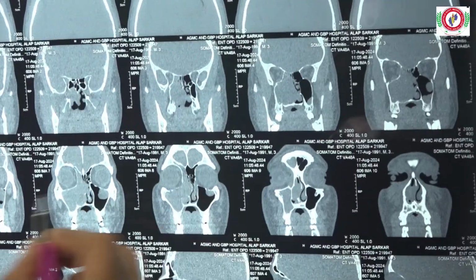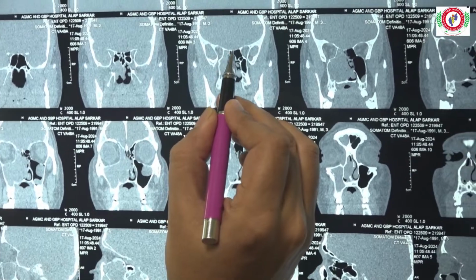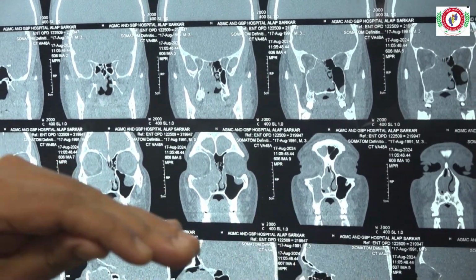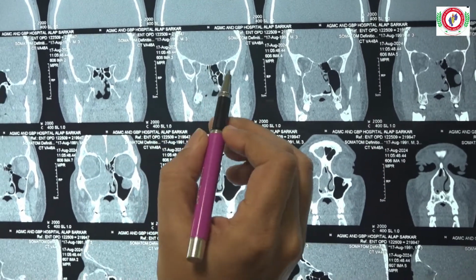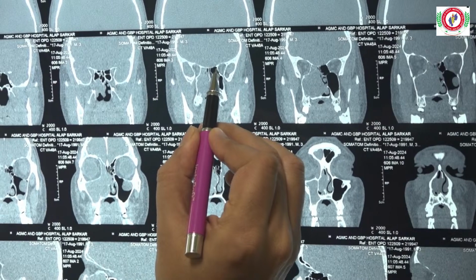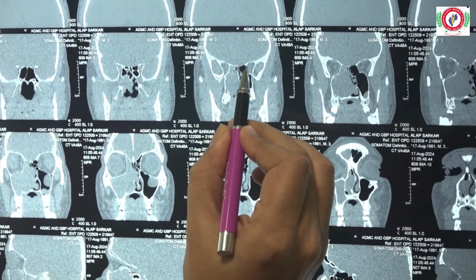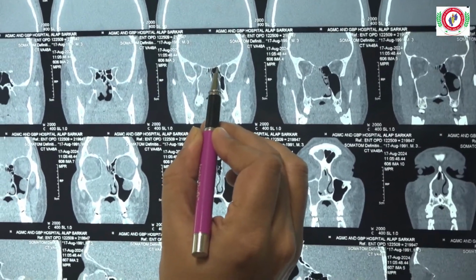Now till this point there is no sphenoid sinus. Alright, it is all posterior ethmoids. And also note the skull base. See the skull base anteriorly, how slanting it is, how it is divided into the medial and the lateral lamina. And see the skull base in the posterior ethmoids. It is thick, it is flat.